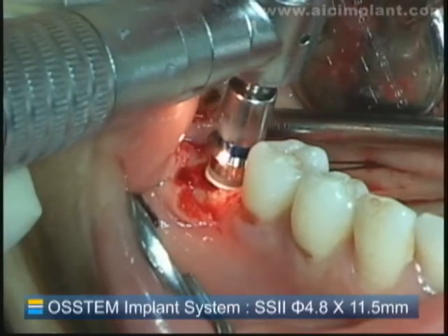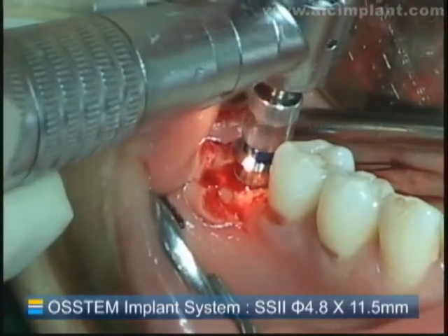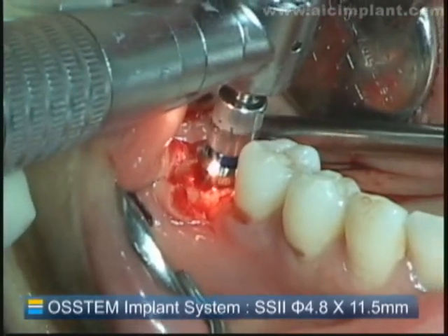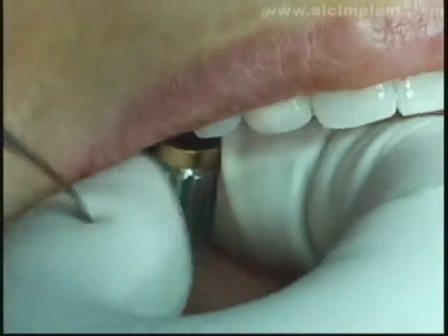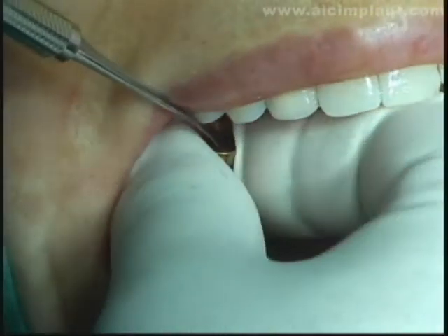The depth control of SS can be done exactly by installing the fixture on the border of the surface treated and untreated area. Since the fixation is good, the fixture mount may be removed without using an open wrench.